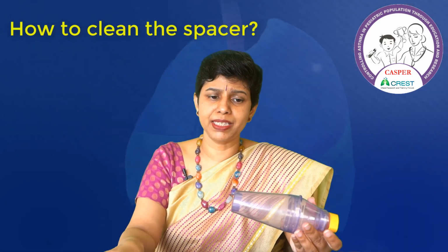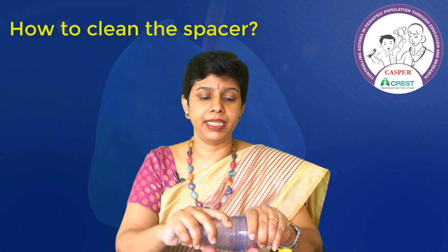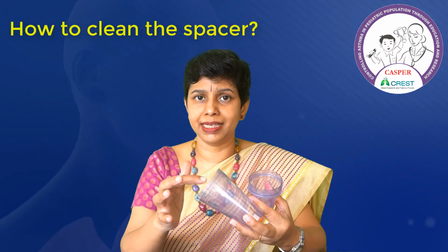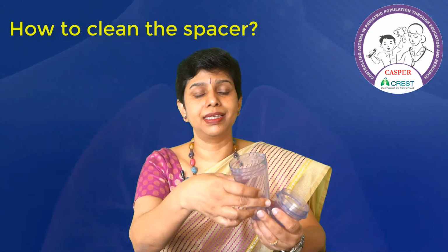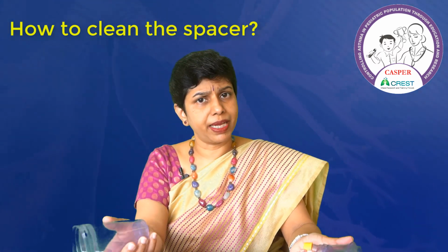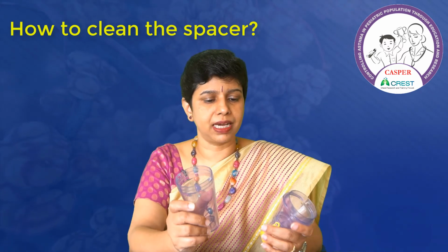How do we clean the spacer? It is very important that we clean the spacer because there is likelihood of bacterial growth inside it. I have seen personally fungus growing inside the spacer. So it's very important that we ask the parents to bring the spacer, bring all the devices, and inspect the device ourselves.